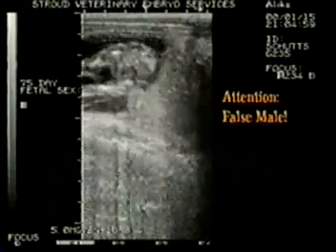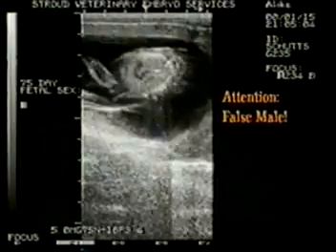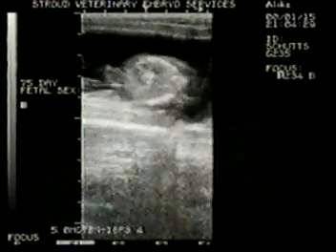This is the same sequence again without freeze frame interruptions. Focus on the tip of the tail and understand how it could be confused as being a MLGT, especially as it hangs between the back legs.